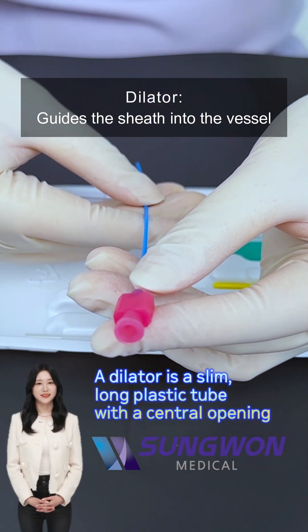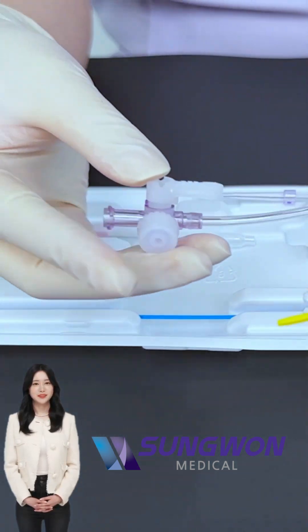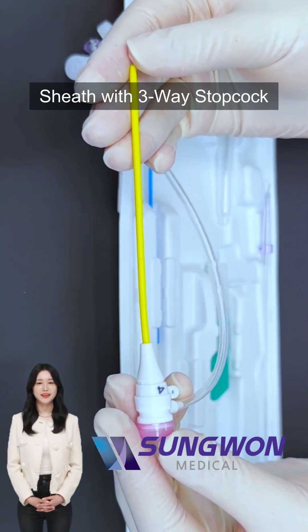Then you slide in the sheath, a short plastic cannula that remains inside the vessel. Notice the three-way stopcock attached — that helps control fluid, pressure measurement, or medication injection as needed.